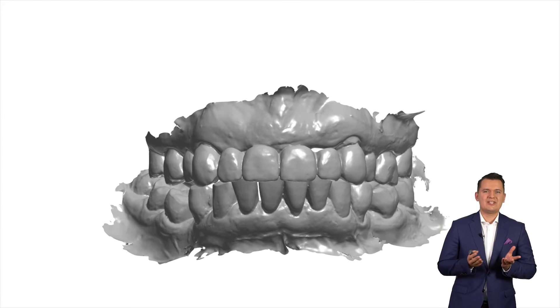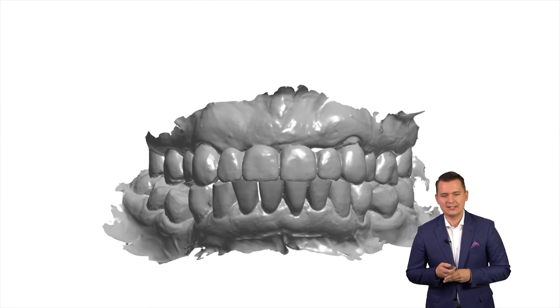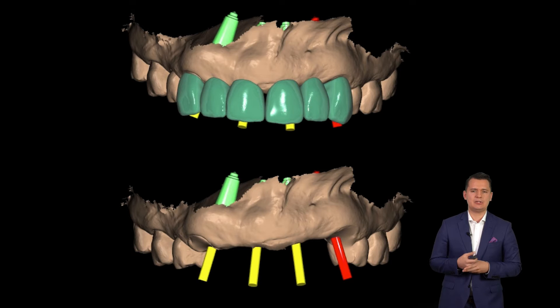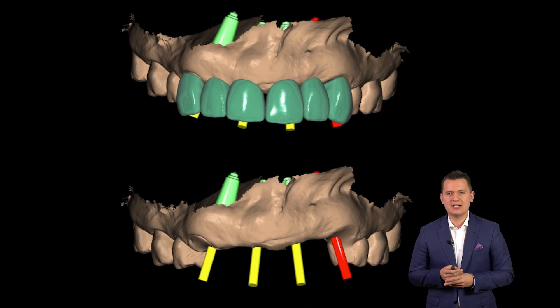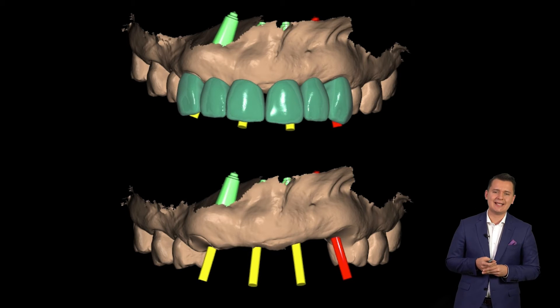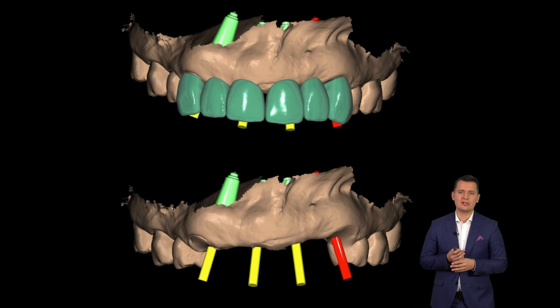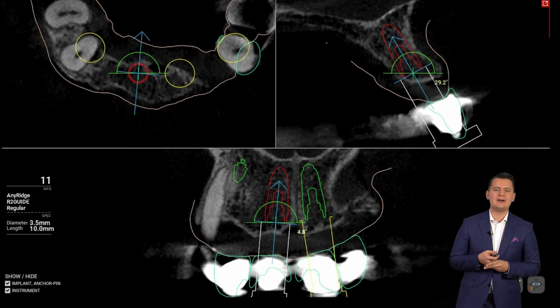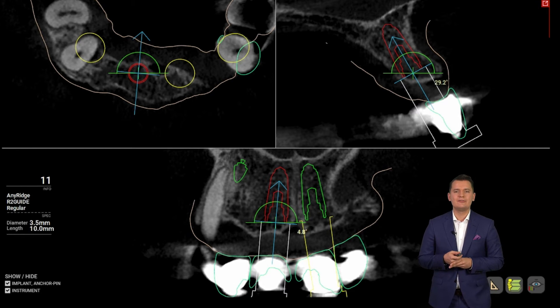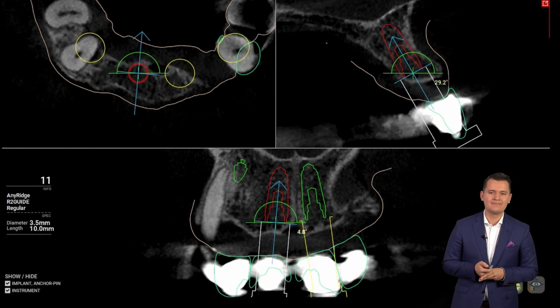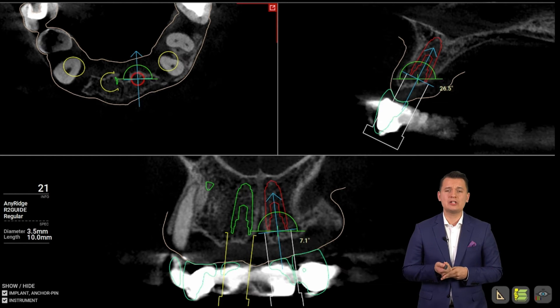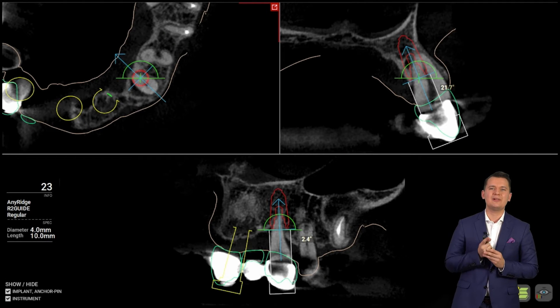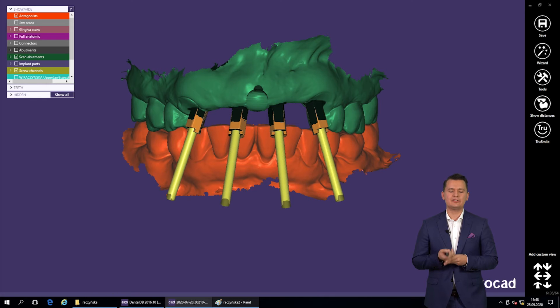First of all, we start with intraoral scanners — we scan the patients. After that, we take the CBCT and start the planning. In this case, the patient had a bridge for more than 15 years based on the canine; she was missing the lateral and central incisors in the upper jaw. We start with the wax-up and after that we start to make our virtual planning for the implants.